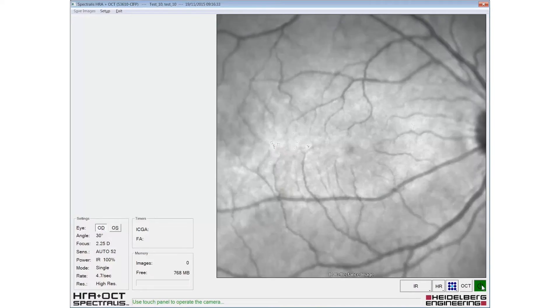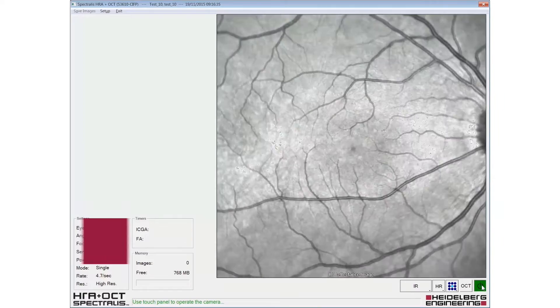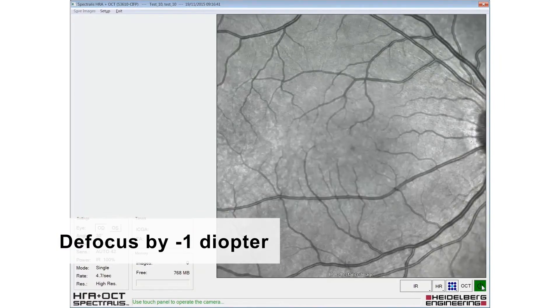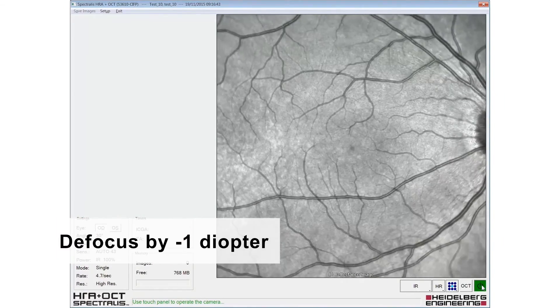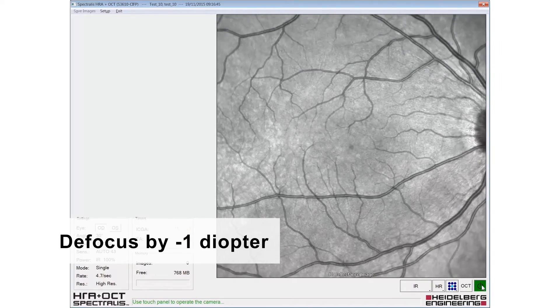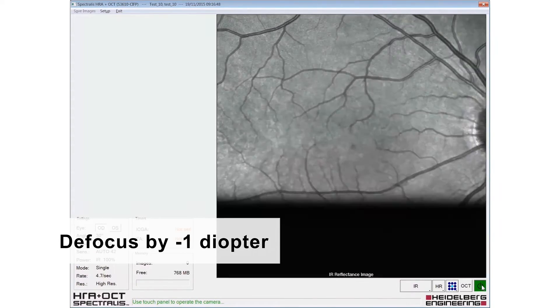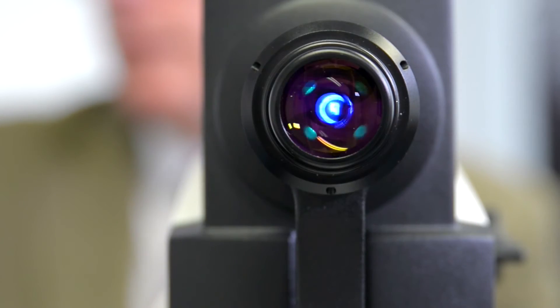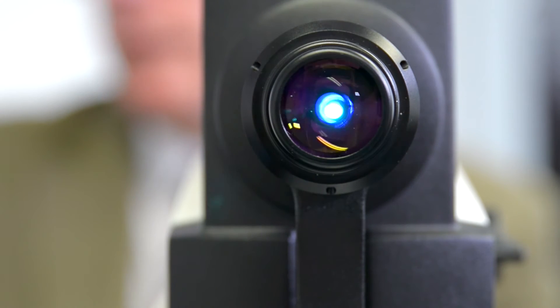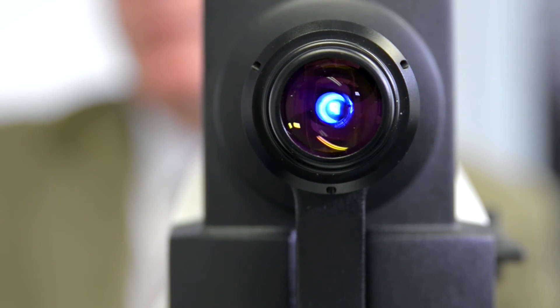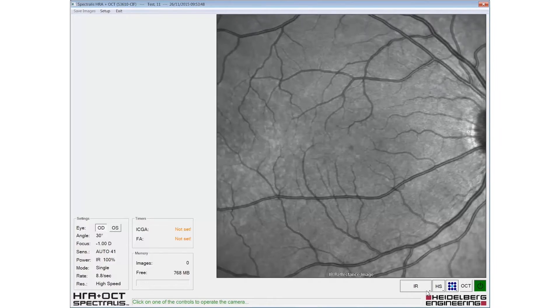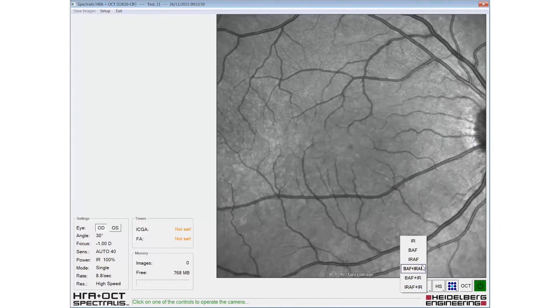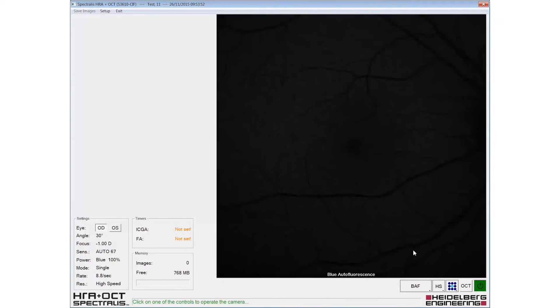The image should be adjusted for sharp focus in the infrared mode and then a minus one dial up to defocus applied before selecting BluePeak autofluorescence. The patient should be reminded that an intense blue light will be used during the examination. The BluePeak autofluorescence modality should be selected from the pop-up menu.